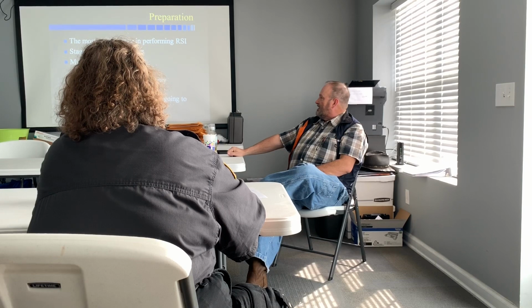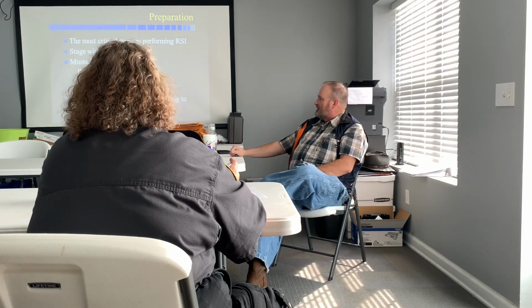All this stuff should be figured out when? In your morning checkoff. And you making sure that everything is there, that it's where it needs to be, and it's working. All right, stage with the most error. Obviously, you gotta have an IV line. Obviously, you gotta have a cardiac monitor, pulse oximetry, and I keep forgetting to put waveform capnography on there too. But waveform capnography goes there, making sure the equipment works.